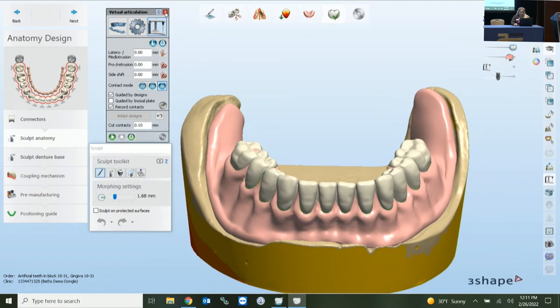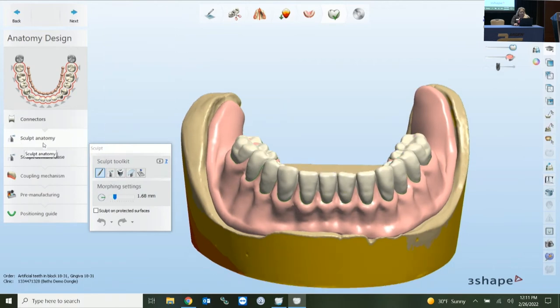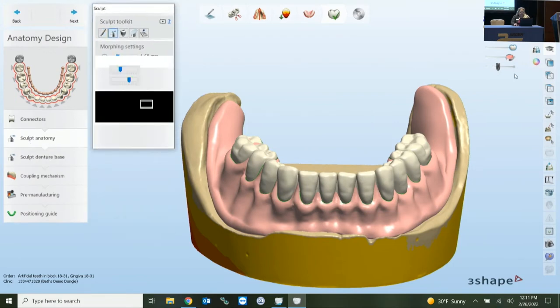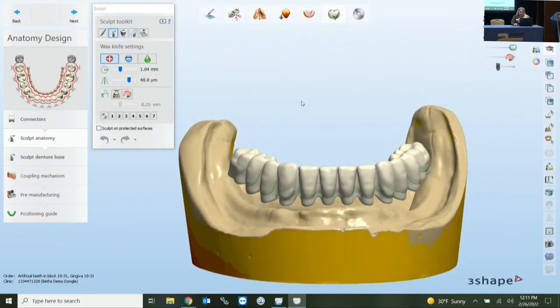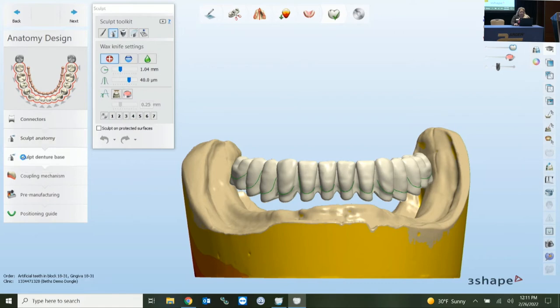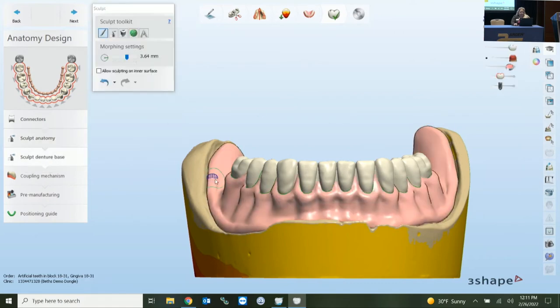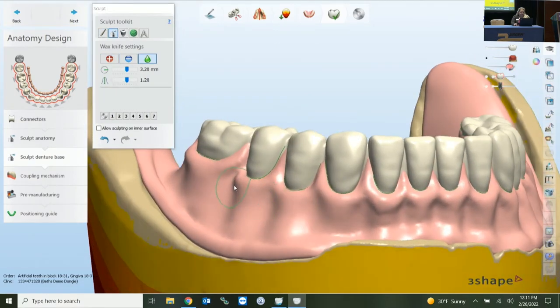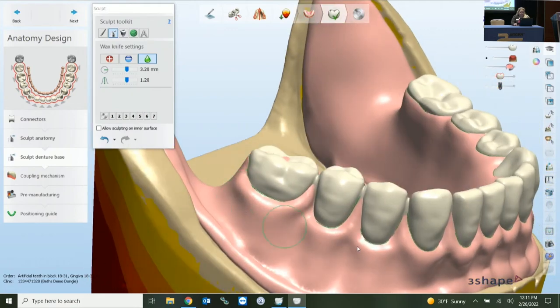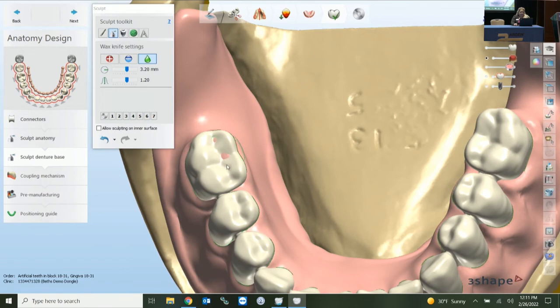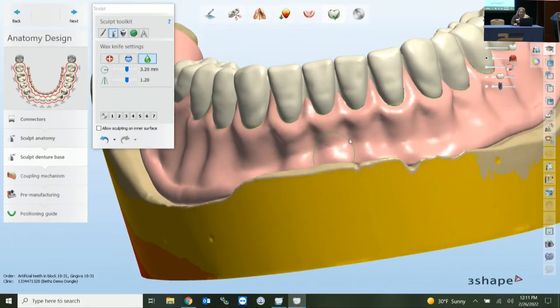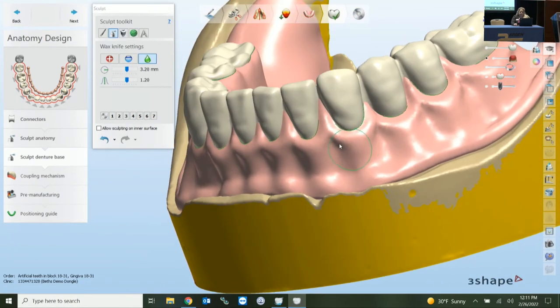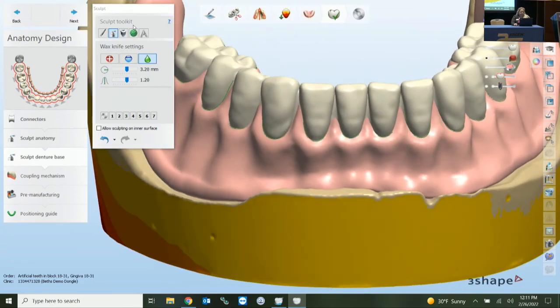Coming out of the articulator, we're on Sculpt Anatomy. You can see there's both 'Sculpt Anatomy' and 'Sculpt Denture Base' — it separates the two so you're able to come in and do what you need to each separately. If you come to Sculpt Denture Base and want to make adjustments, you come in and sculpt wherever with your wax knife.